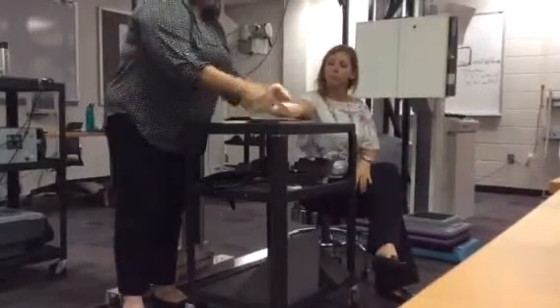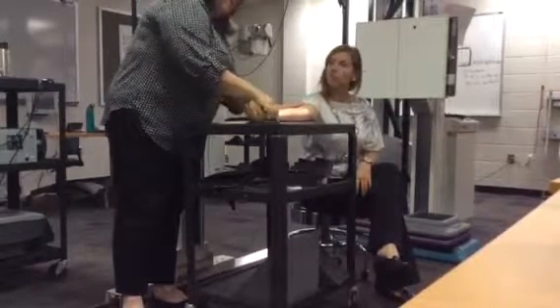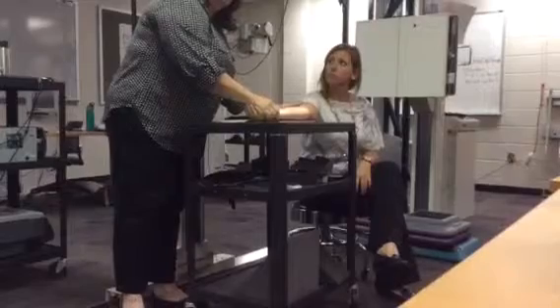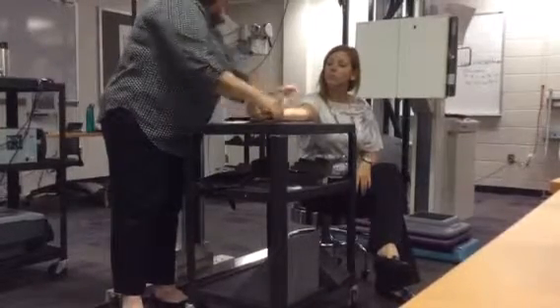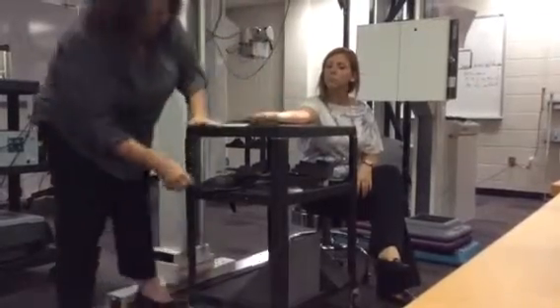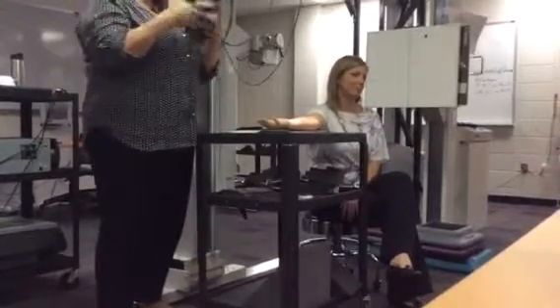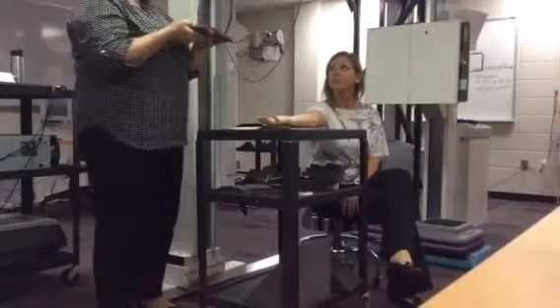Now I'm going to go ahead and position Dr. Zivek here so that we are seeing the distal radius and ulna. So it's about 1.5 inches from the edge of the film. The condyles are parallel to the film. Now you can help your patient hold that position by putting a weight in their hands. This is a 2-pound sandbag, but you can use anything that has some heft to it.